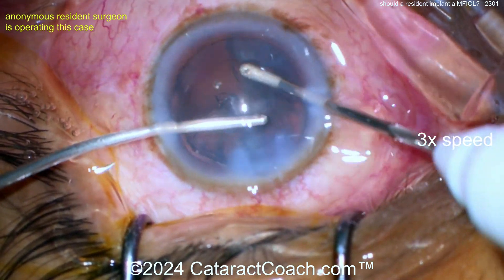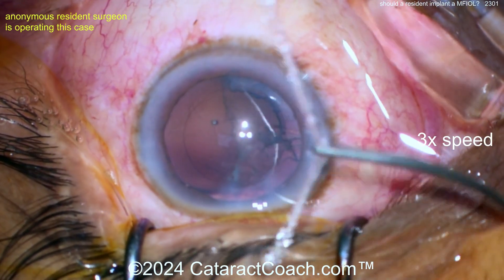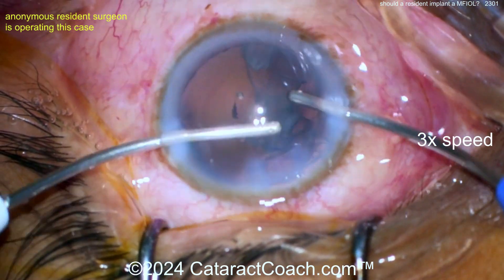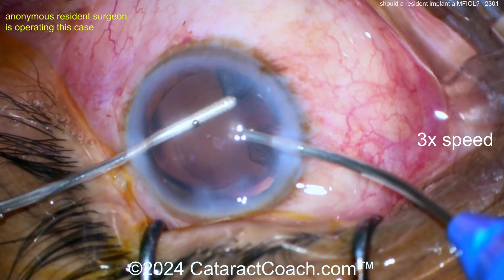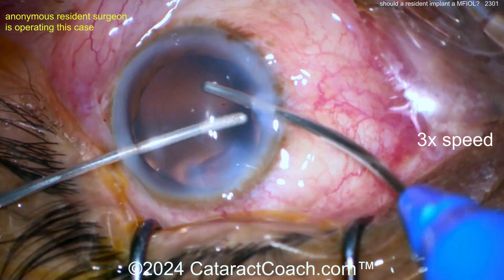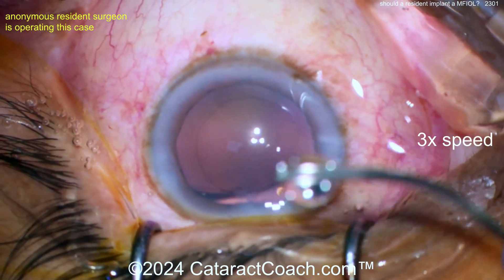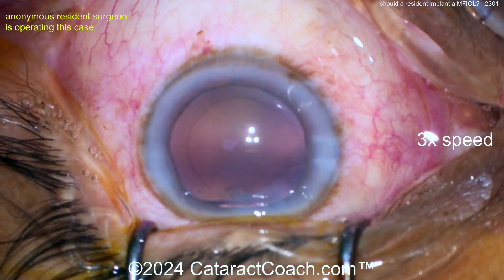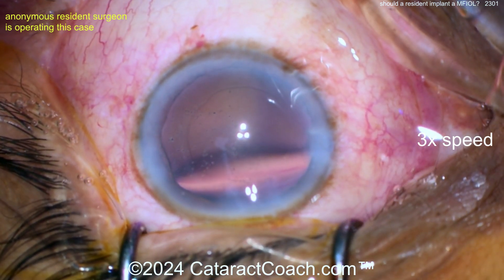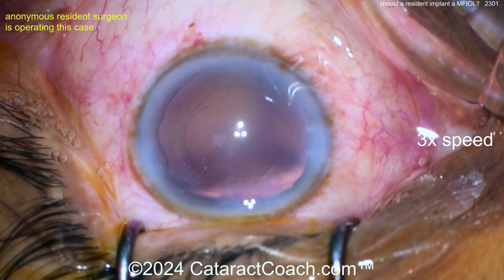This bimanual cleanup is pretty good — again, this doesn't look like 50 cases to me. When you do a multifocal or trifocal specialty lens, you have to hit your target. I've found very few residents in more than 20 years of teaching who track their surgeries — their IOL power targets versus actual outcomes — or who measure their surgically induced astigmatism (SIA): pre-op and post-op, knowing what their incision will cause in terms of flattening at that meridian. You should be doing that, but you're not doing that at less than 50 cases.